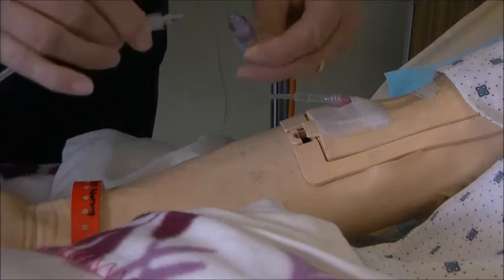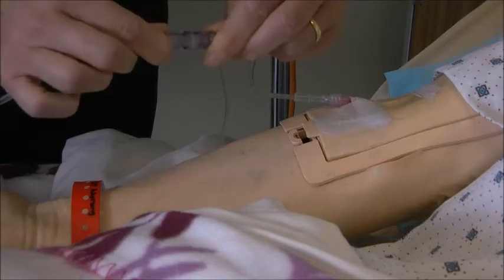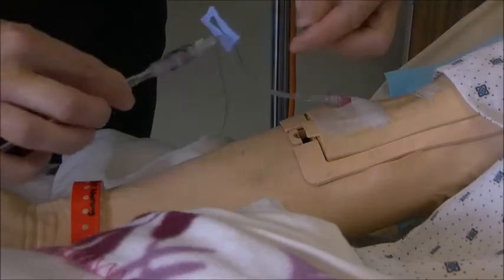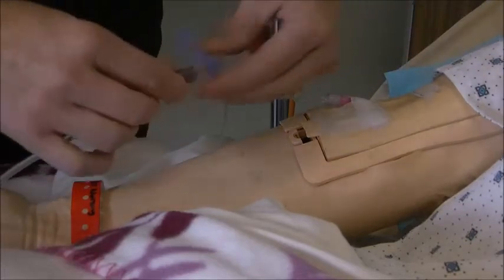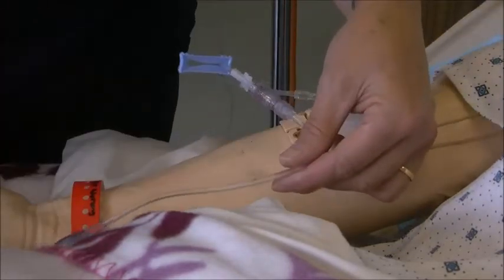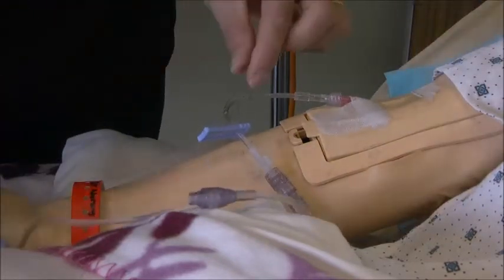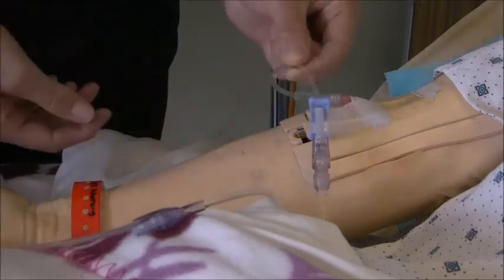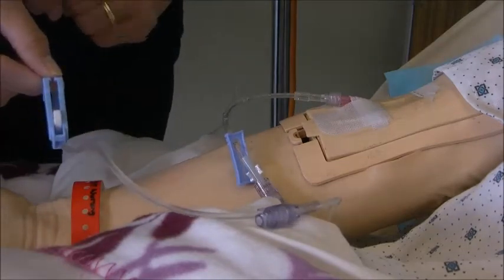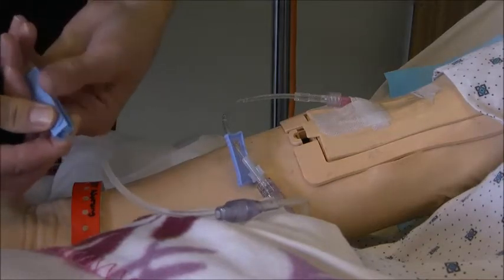That has a plastic valve in it, and that just simply connects by pushing it in, bringing that collar down and turning it around. See how that's connected? So now I've done that, I can start my IV going. Remember that when you go to start your IV, you're going to need to undo all the things that are going to stop the flow. So this would be one, so undo that one. When you connect it to the machine, you're going to want to undo that roller clamp all the way. So it's connected to my machine now, so I'm going to undo that one.